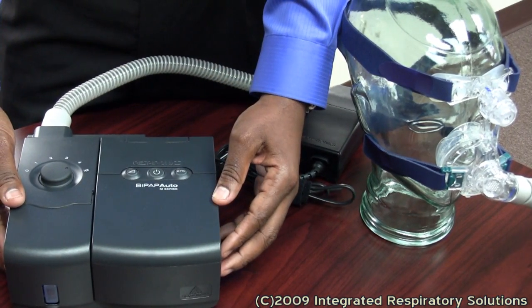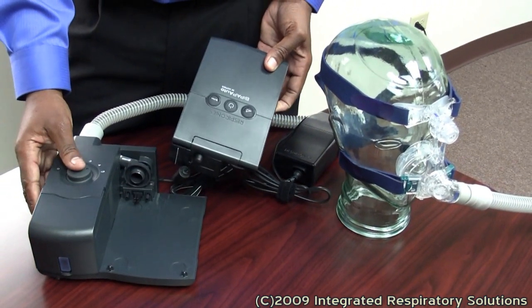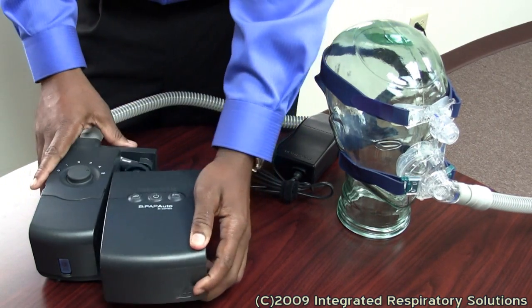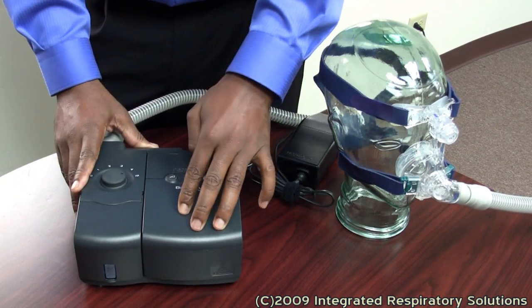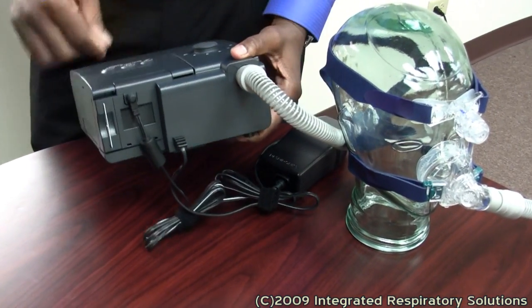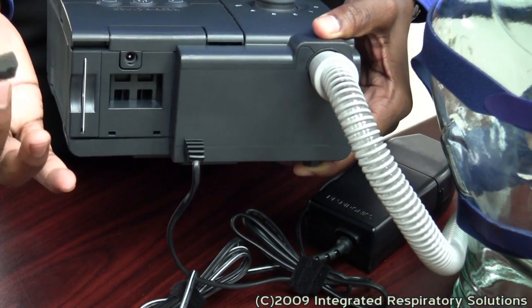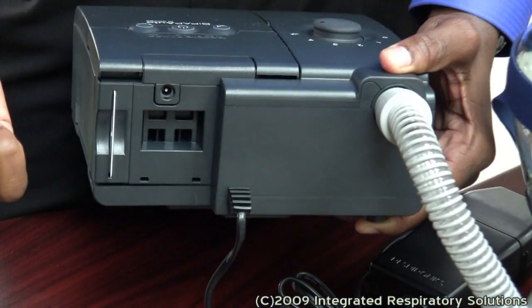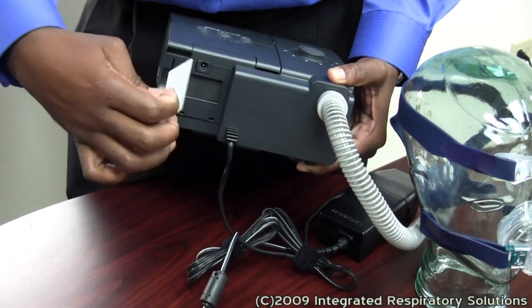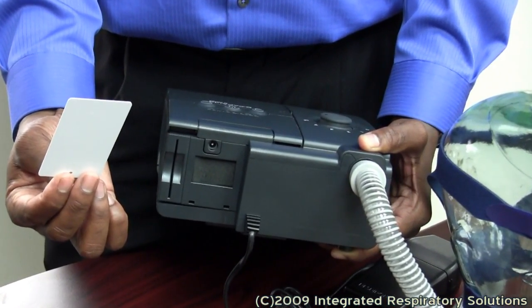This device separates from the humidifier, though your doctor will often suggest that they are used integrated together. On the back of the device, filters are located here. The device comes with a pollen filter as well as an ultrafine filter. It also has a smart card, which records compliance information while you sleep.